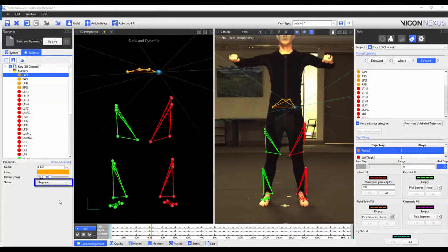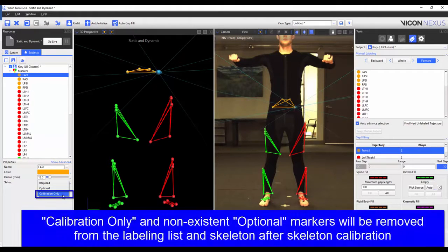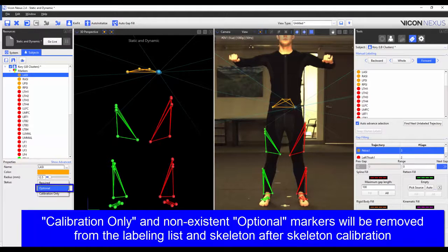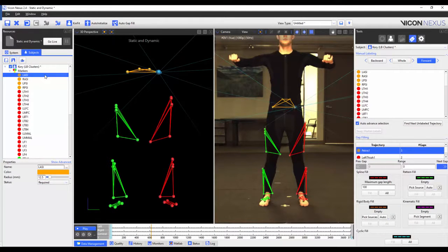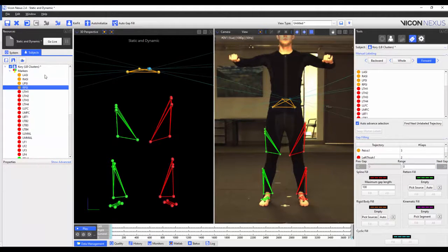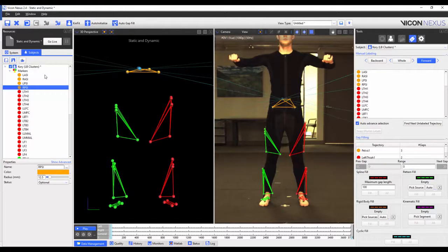We can set the marker status to required, where the marker has to be in both the calibration and dynamic trials; or to calibration only, where the marker is only required to be in the calibration trial; or as an optional marker, where if it's present in the calibration trial it is treated as a required marker, and if it's not present it is treated as a calibration only marker. By default, the first three markers on a segment are set to required, and every subsequent marker is set to optional. For my VST, I'm going to set all of the markers on the cluster to required, and those on the knee and ankle joints to calibration only.